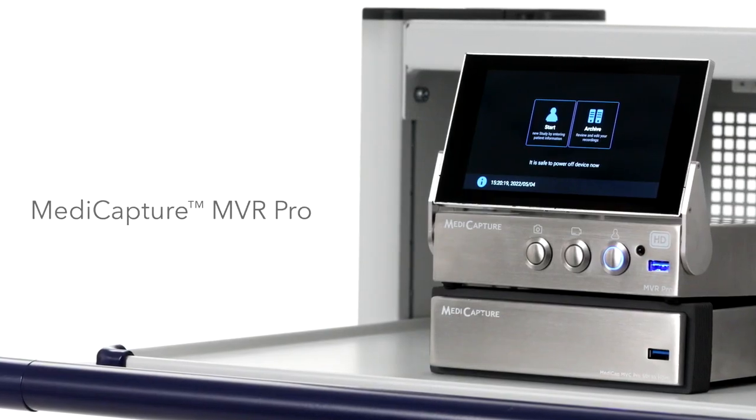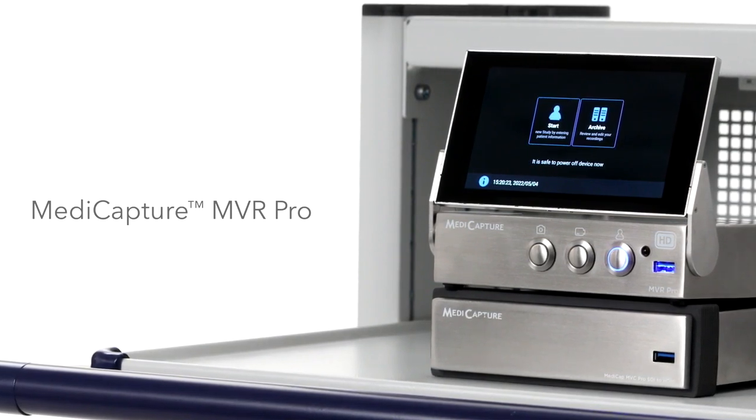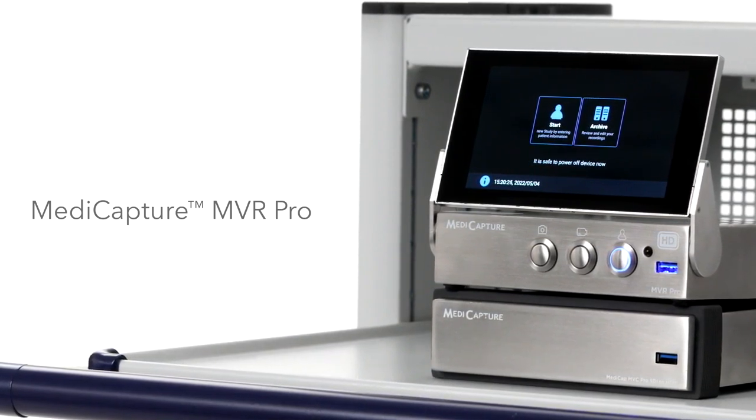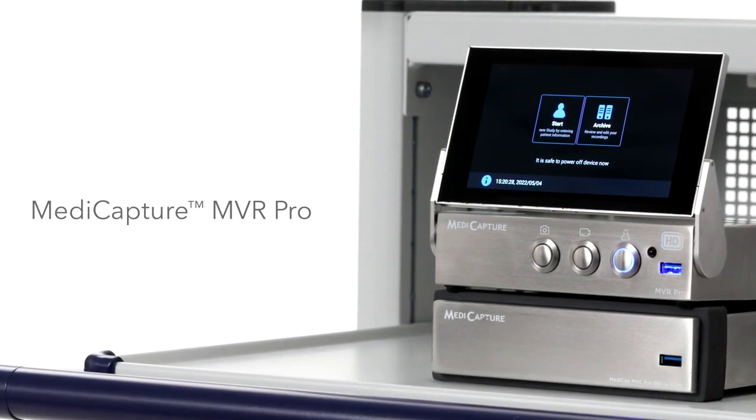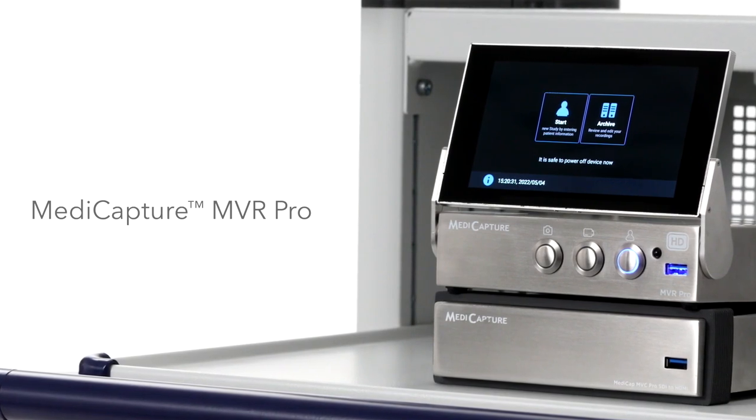The MediCapture MVR Pro is a specialized yet easy-to-use medical video recorder. It features full HD and 4K recording at 60 frames per second and allows network flow capabilities like DICOM and PACS.